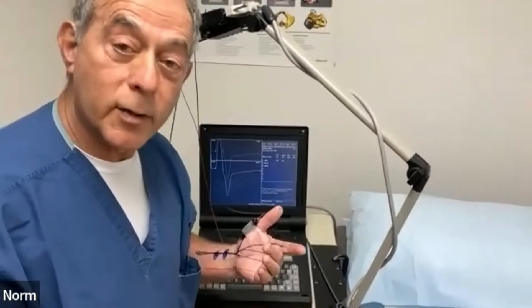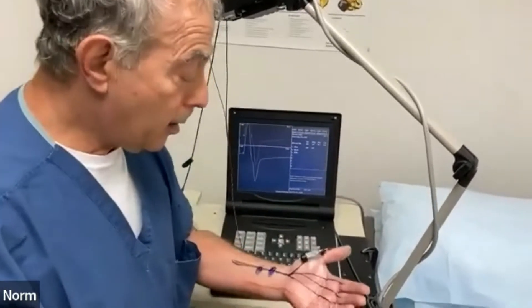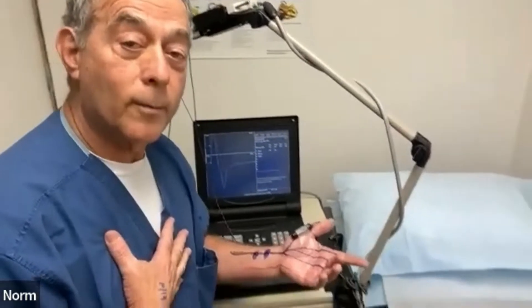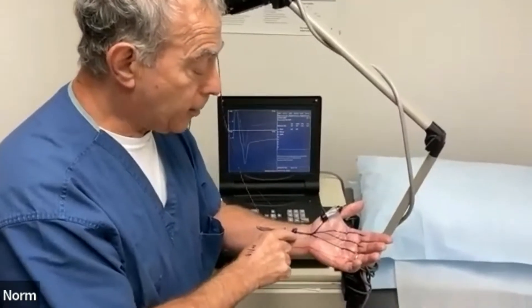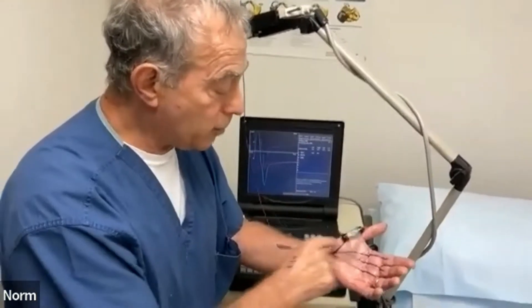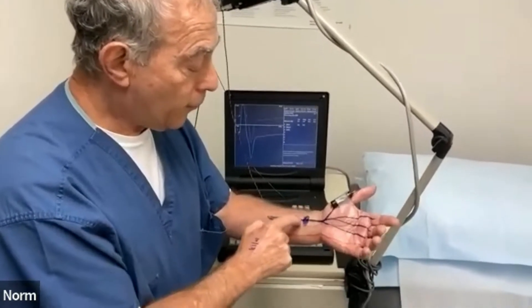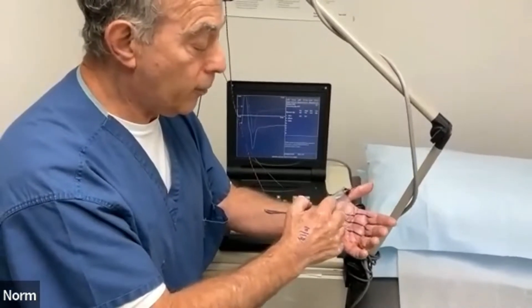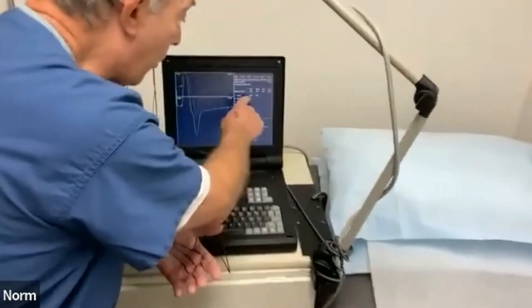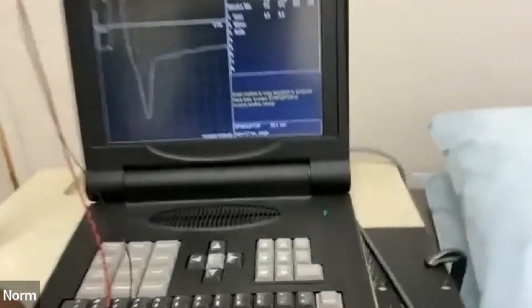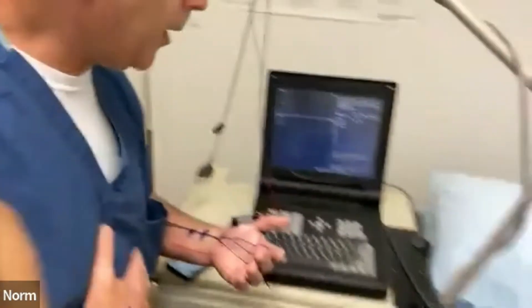The focus today is really on nerve conduction studies. What I've shown is that I'm able to determine that I have mild carpal tunnel syndrome just by a simple stimulation of the nerve. There are many different studies with different measurements, but most follow about an eight centimeter distance from the stimulation point to the recording of the muscle — that's the latency. My latency today was 4.6 milliseconds; 4.3 or less would have been better.